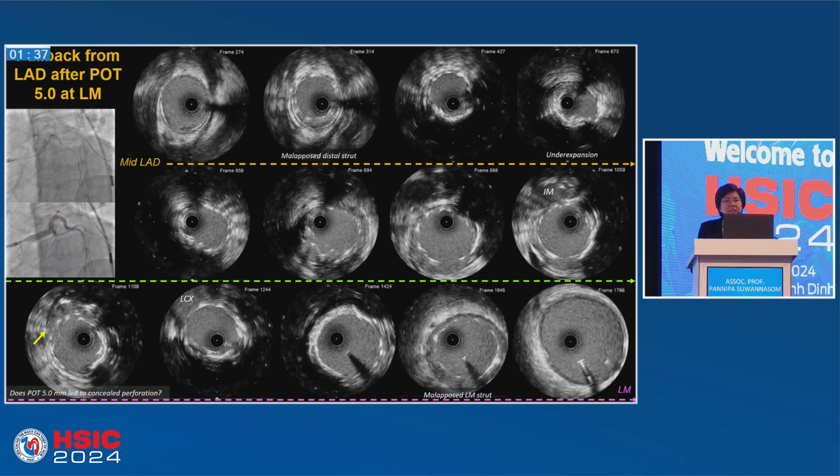So as you can see here, the stent in the LAD is still not in good expansion. So I think, okay, I will do the post-dilation after I fix the problem with this intermediate. But previously you saw the very beautiful opening of the intermediate, and now I just see it like this. And as you can see, there's a discontinuation of the media around here.